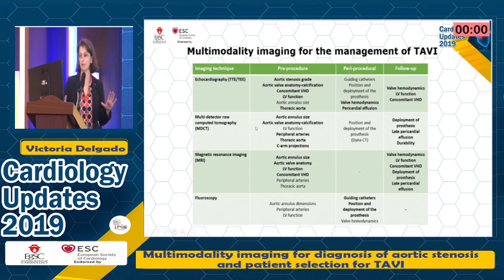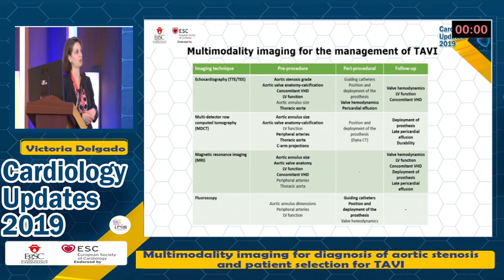With this table, I summarize how to use multimodality imaging for the management of patients with TAVI, with the different imaging techniques, when to use them in the pre-procedure and what to check for, what to use during the procedure, and at follow-up. And I thank you very much for your attention.